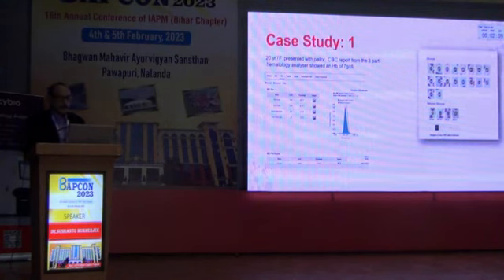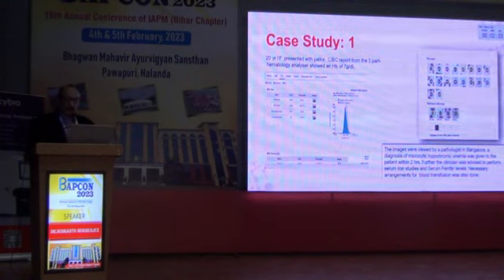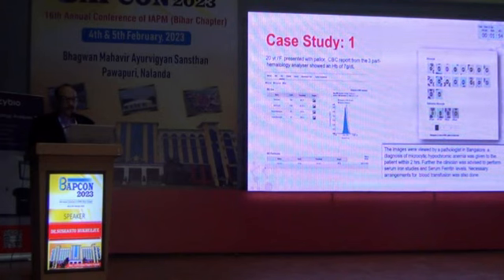Two cases I will just write about here. This has been done by Anand Pathology, Bangalore, where the images were viewed by a pathologist in Bangalore and the diagnosis of a microcytic hypochromic anemia was given within 2 hours. It's a normal slide, basically iron deficiency.